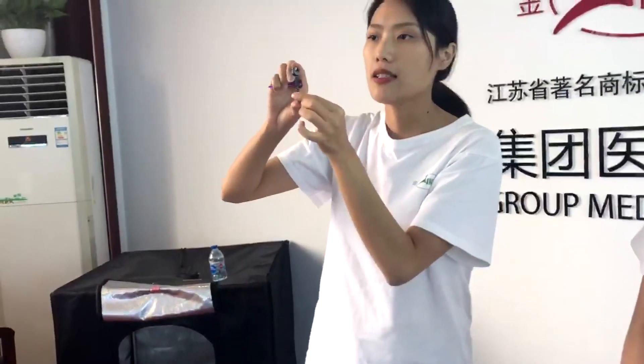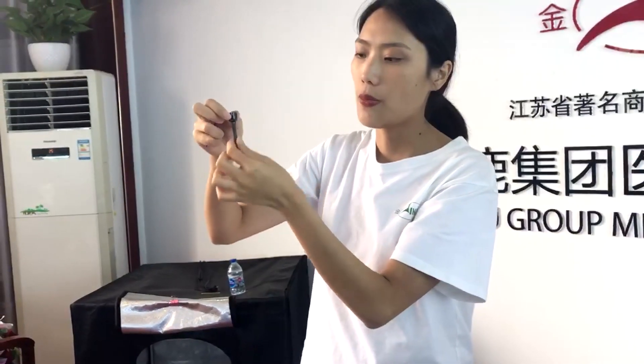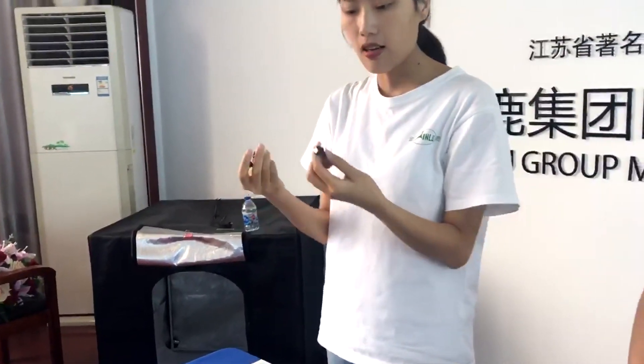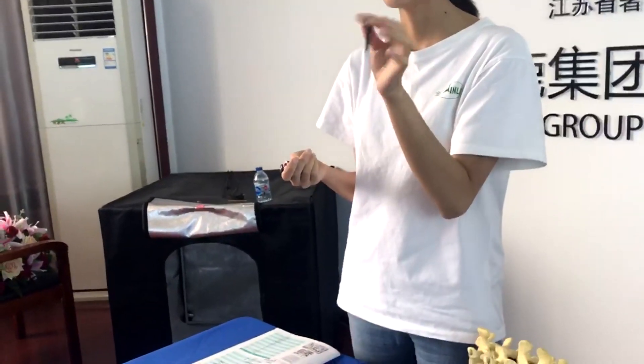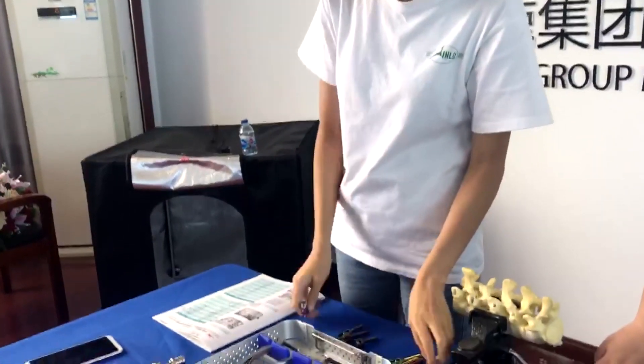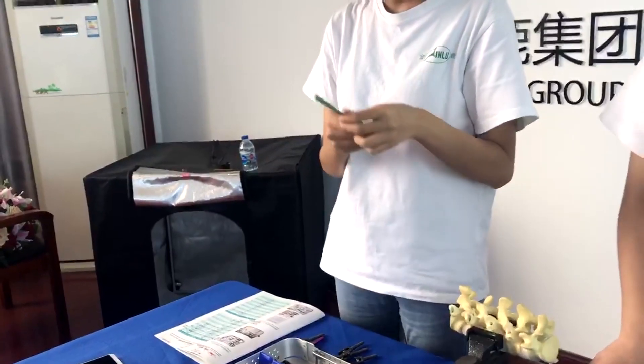With the new design pedicle screw, it will be more stable because this part is cancellous. The diameter of the screws ranges from 4.5 to 7.0 millimeters.